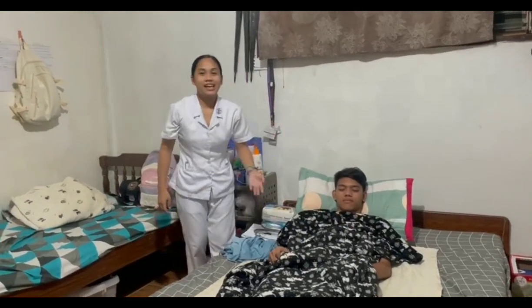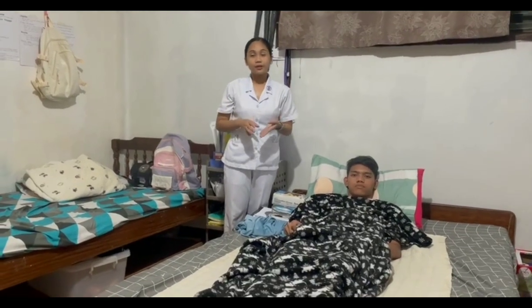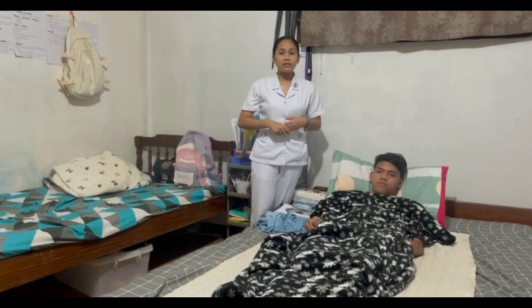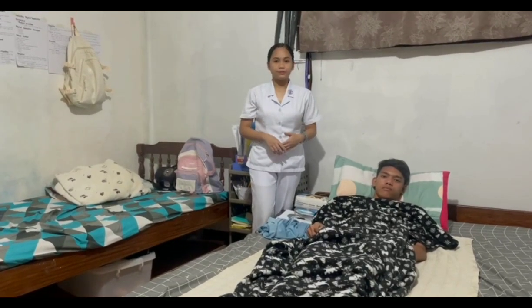Okay, and for this part, I will assess the patient's heart rate and rhythm by placing the diaphragm of my stethoscope to listen for high-pitched sounds at the apex, listening to the rate and rhythm of the apical impulse.